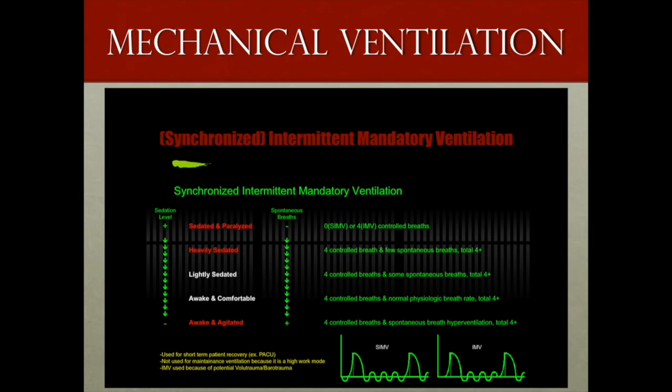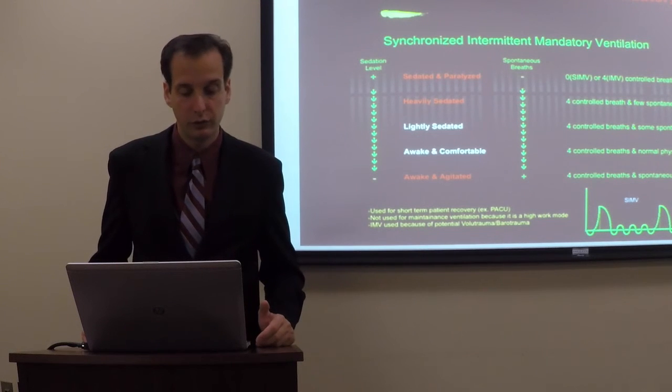If I am heavily sedated, you would find that I would likely get my 4 breaths if I were in SIMV, or you definitely would if you were in IMV. However, you would probably have inadequate spontaneous respirations in between. As sedation is lightened, the risk of hypoventilation becomes less, and lightly sedated patients are ideal candidates for SIMV. Awake and comfortable as well. You would get your 4 mandatory breaths that are set, and then you would breathe spontaneously in between. Again, awake and agitated is not ideal, but in this case, it's better than assist control at least.